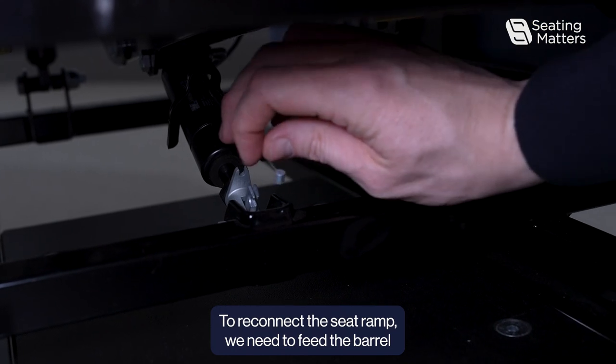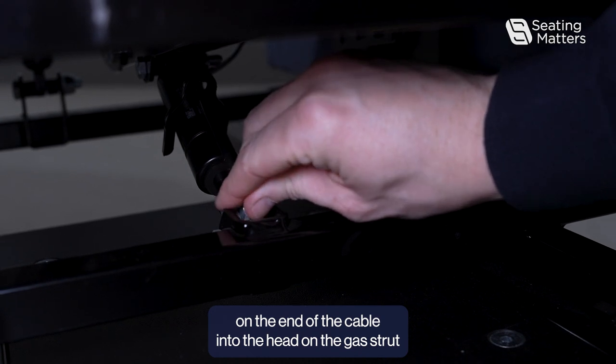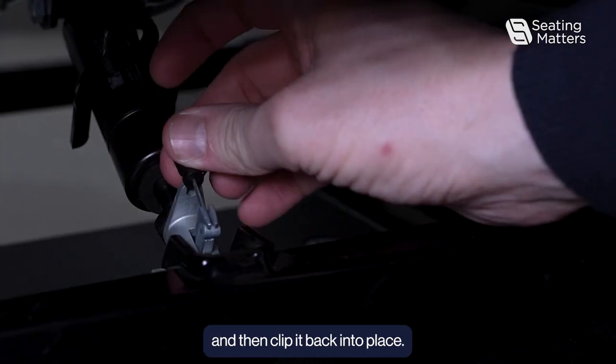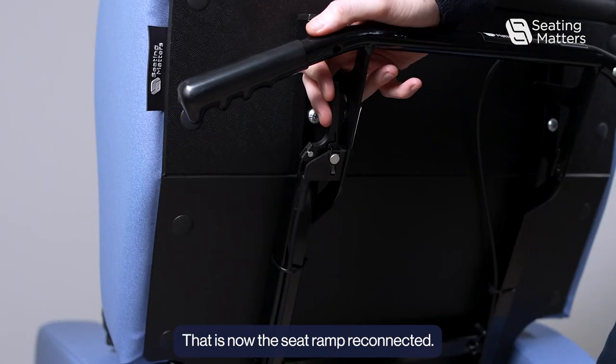To reconnect the seat ramp, we need to feed the barrel on the end of the cable into the head on the gas strut and then clip it back into place. That is now the seat ramp reconnected.